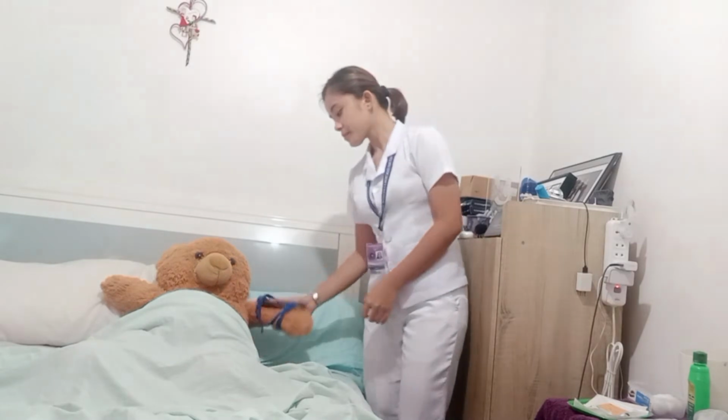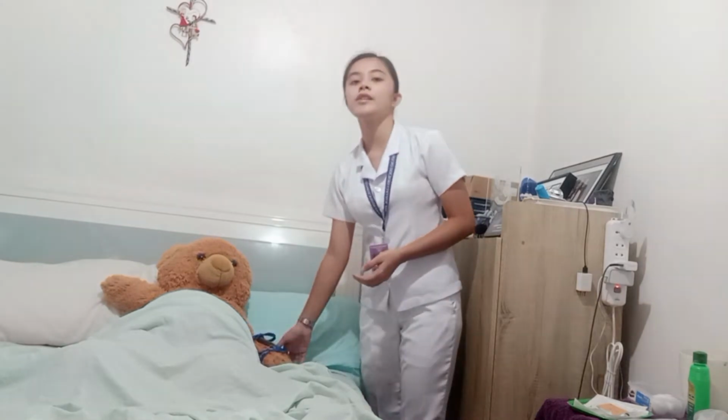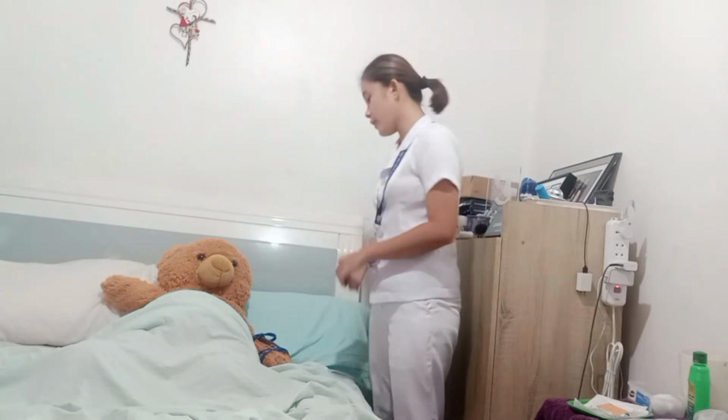Now choose an injection site free of lesions and discoloration. So select the site 3 to 4 finger widths below the antecubital space and one hand above the wrist. So the forearm is convenient in this location for the introduction of agent intradermally. Thus, this is the site that I chose. So position the patient's arm so that her elbow and forearm are supported on a flat surface.